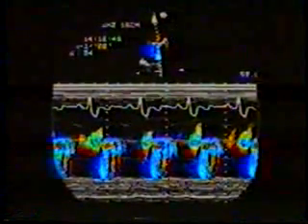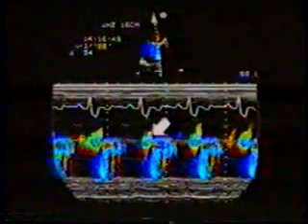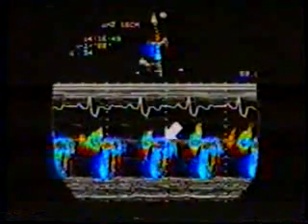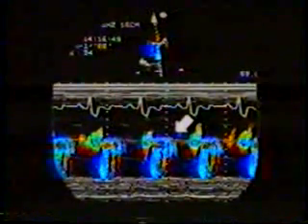For precise timing of these dynamic events, we will frequently utilize color M mode examination. Here you can see during early systole, mosaic color jet is directed across the defect into right ventricular outflow tract and can be seen here. Now, during late systole, the flow is reversed in the opposite direction shown here in the shades of blue. Note further that during the diastolic phase of cardiac cycle, there is continued right to left shunt across this defect into the left ventricle. Now observe this in real time.